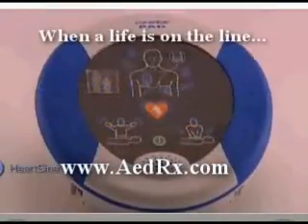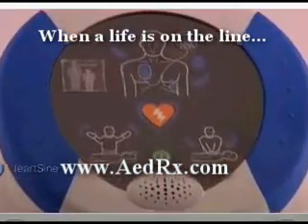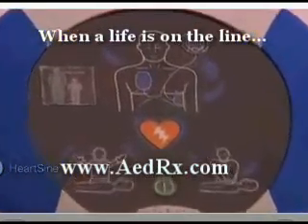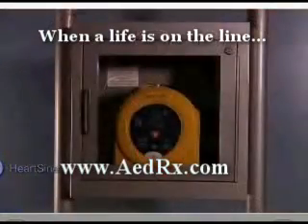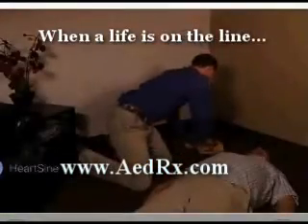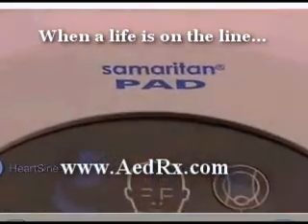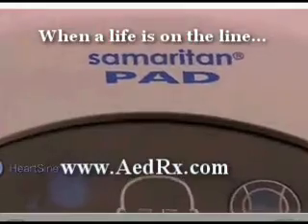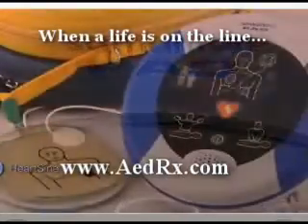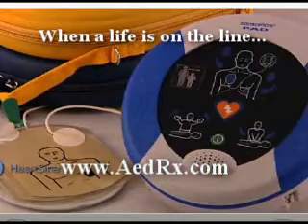With little or no training, rescuers of any skill level can confidently use the HeartSine Samaritan PAD's life saving technology. With the unit nearby, you are always prepared to respond when minutes are critical and a life is on the line. At a moment like that, you'll need the proven superior design and technology, the lightweight durability, and the intuitive ease of use that only the HeartSine Samaritan PAD can offer.